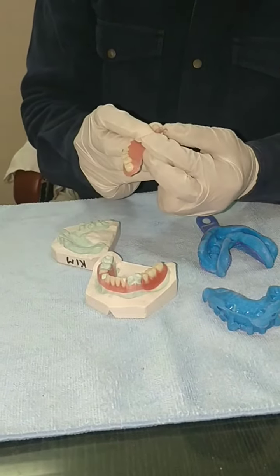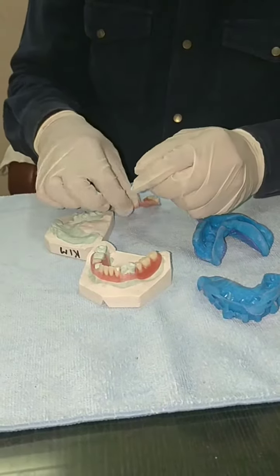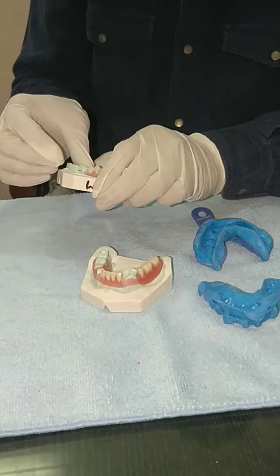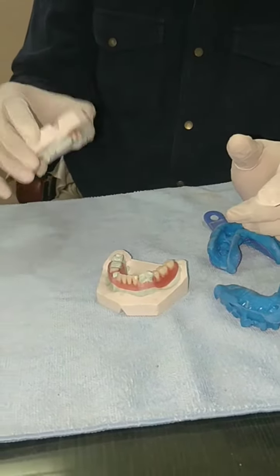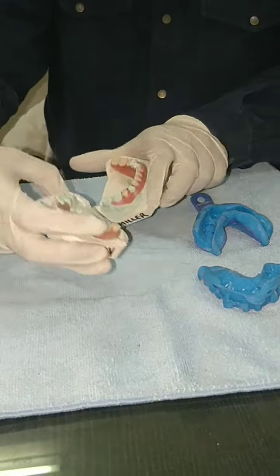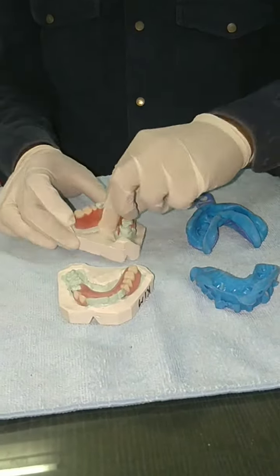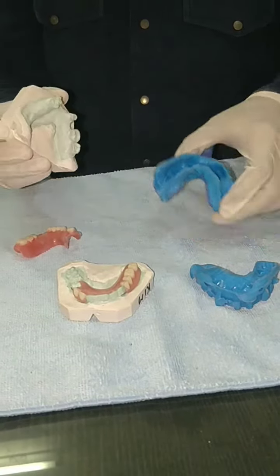This is the steel wire clasp — you can just press it inward and they can wear it like this. You can see now it would be in retention. So this was the upper and lower partial for the respective upper and lower impression trays.